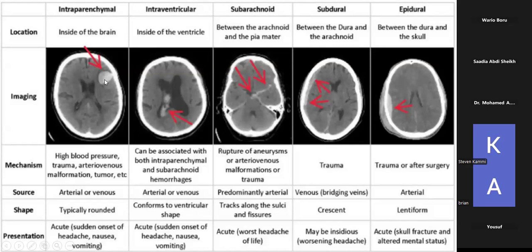And inside the brain, you have here, this is called a parenchymal bleed or intracortical bleed. Then inside completely, further in relative to the brain parenchyma, you can have a bleed in the ventricles. And this is what we call an intraventricular bleed.